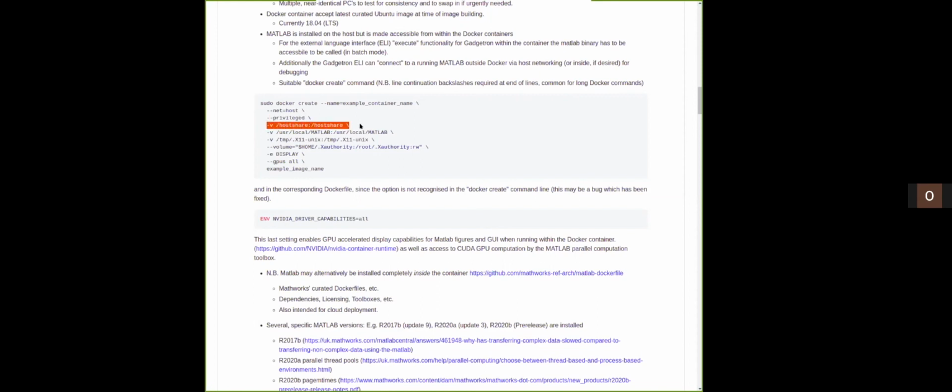So we typically have some shared folders for transferring information or data to the container or not, and actually we tend to use this also to share by Samba to the scanner host. We allow the whole of the MATLAB installation tree through into the container. We allow the container to access the X server on the host machine. We allow GPU access, so the container can have access to NVIDIA GPUs. This is now native within Docker since 19.03.